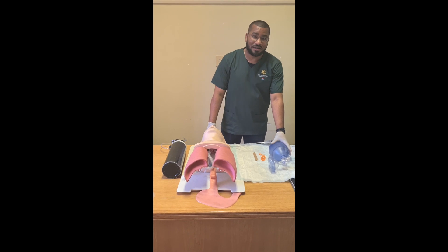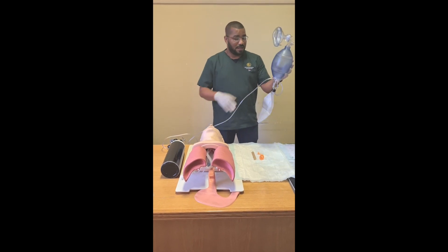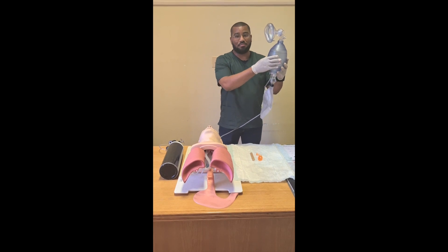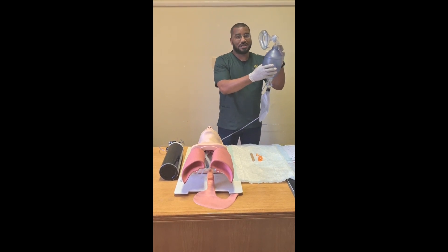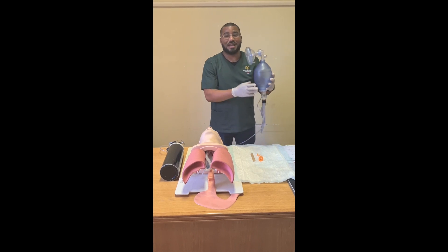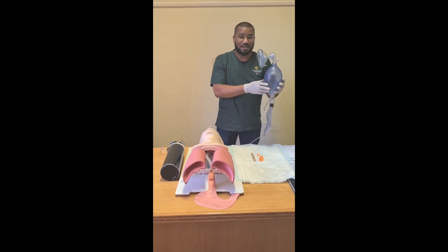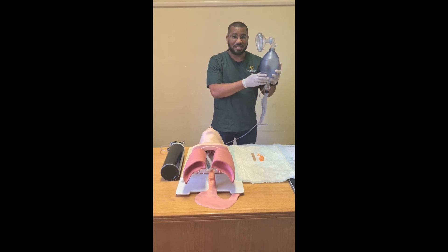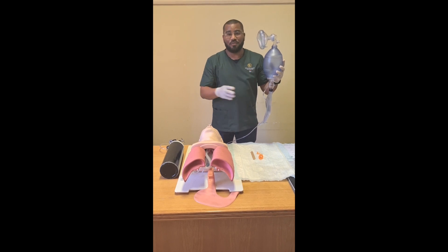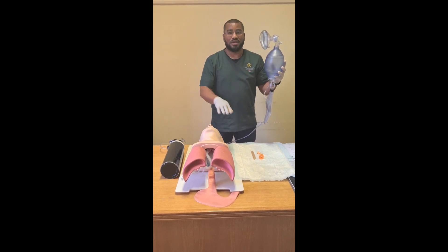I'll start off with the BVM-R. BVM is a device which consists of a bag, valves, a mask, and a reservoir — hence the name BVM-R. If assembled correctly, this device provides a one-way valve and flow of 100% oxygen from the oxygen cylinder to the patient.